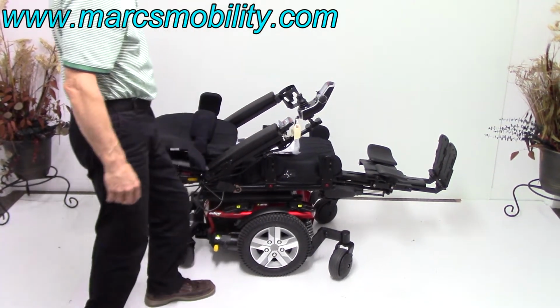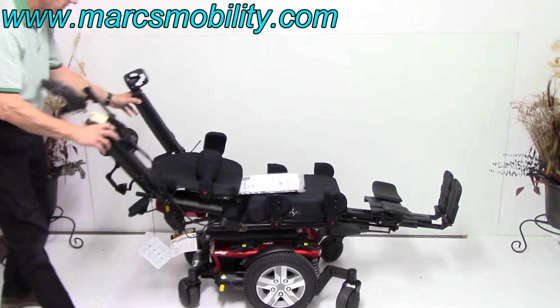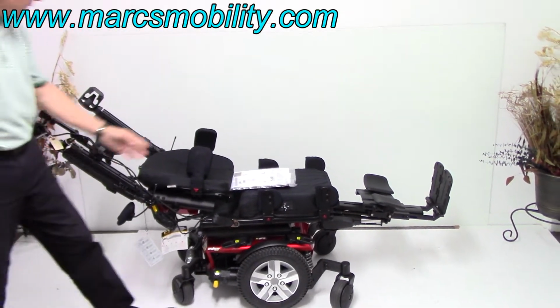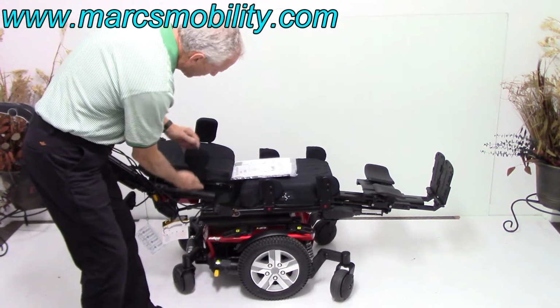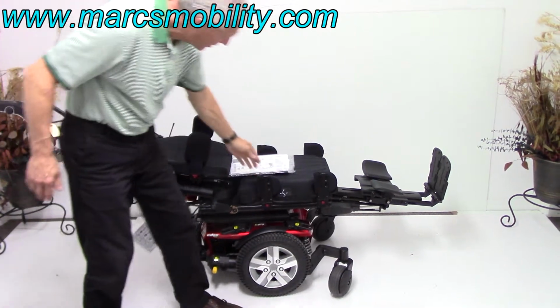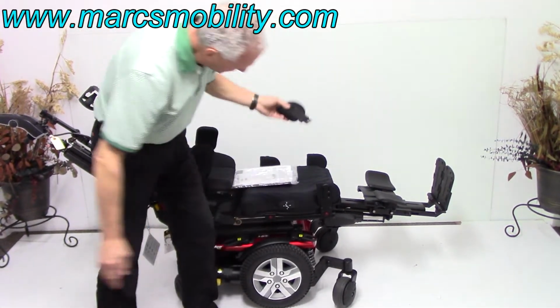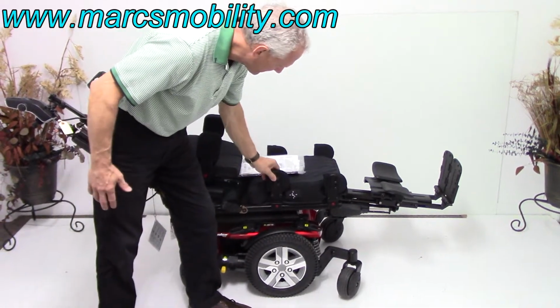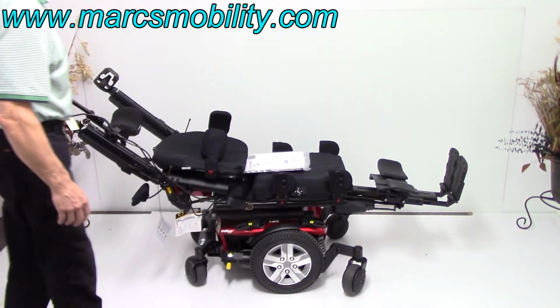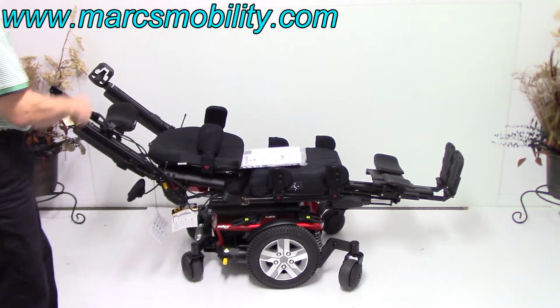Okay? These arms do flip out of the way. These lateral pads for the chest can also be removed. If you don't need them to protect you right here, you don't have to have them. You've got lateral pads here. You've got two sets, and they can also be removed, so there's nothing in your way. So this is your full recline in this power chair here with your legs up and your back reclined.